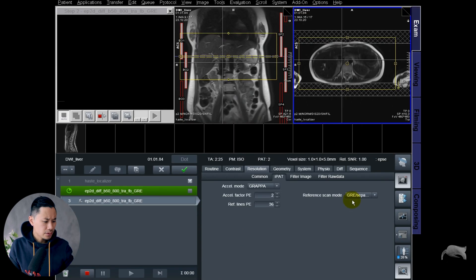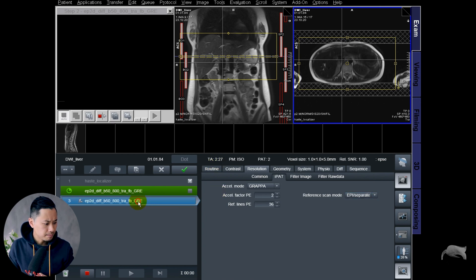So this second scan, we're going to try the EPI and we're going to write EPI right here.